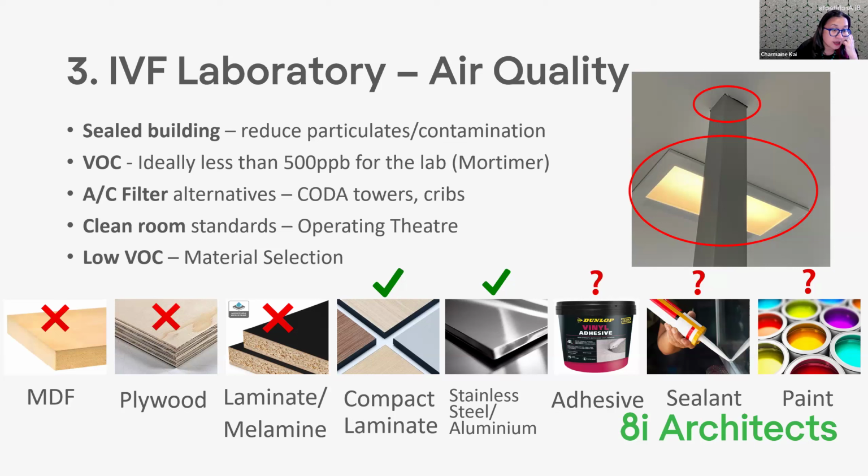Another material that's not great, mainly due to the glues, is plywood. So plywood, again, something to avoid in an IVF lab, simply because the glues in it will continue to off-gas.